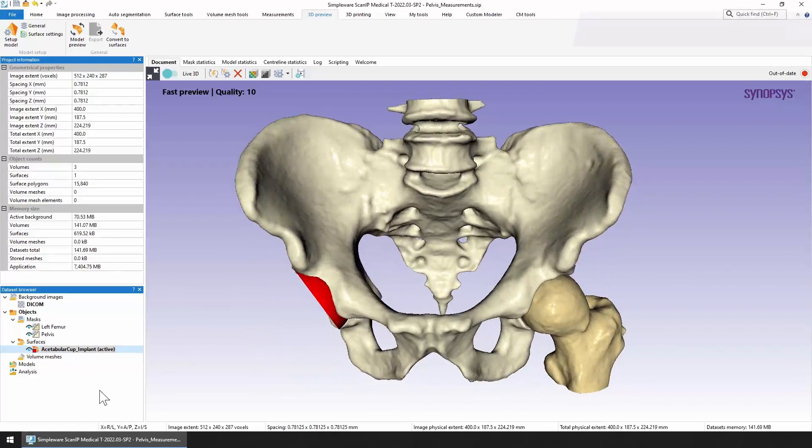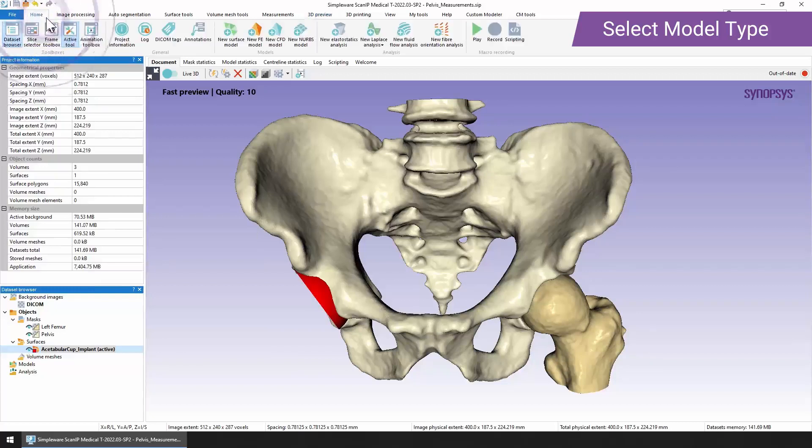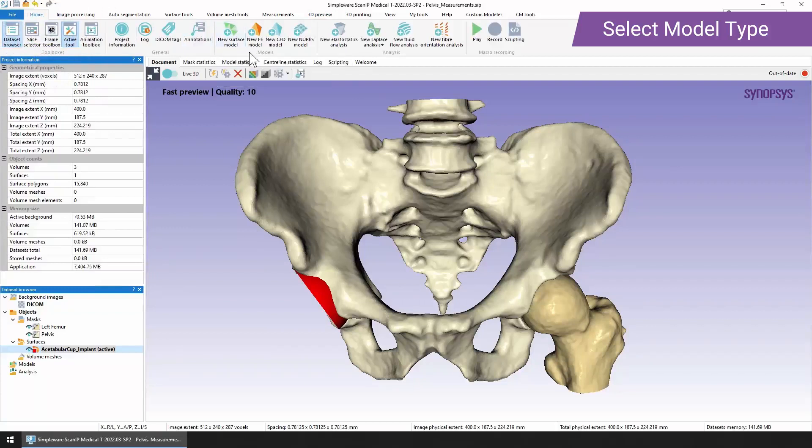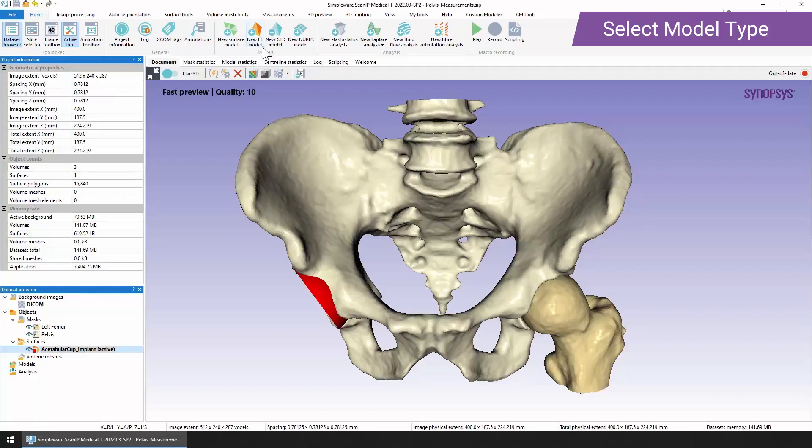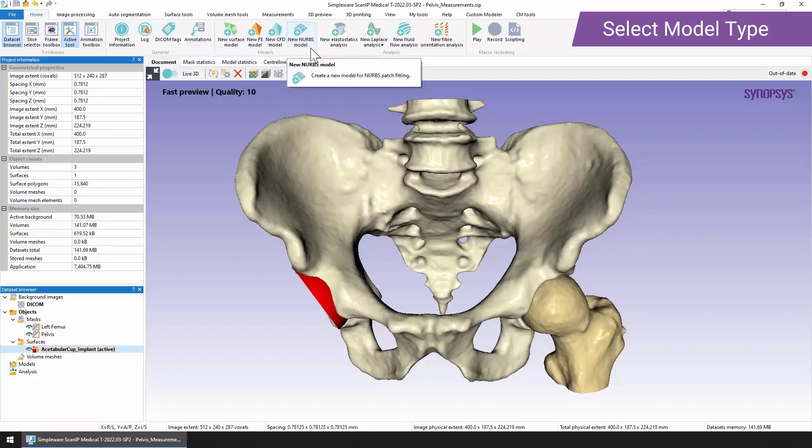We have a selection of different types of models that we can create. If we go to the home tab we can see them all listed here. We can create a new surface model, useful for 3D printing or maybe some FE, CAD, or CFD work. We can create a new FE model that's a volumetric mesh, a CFD model, or a NURBS model. NURBS are larger patches often used in CAD work.